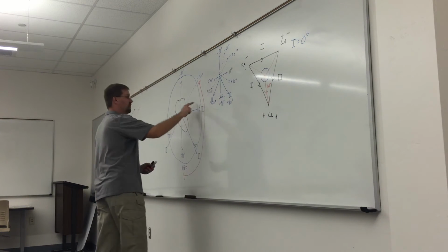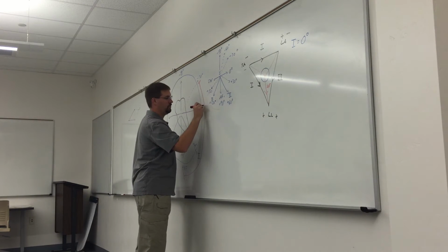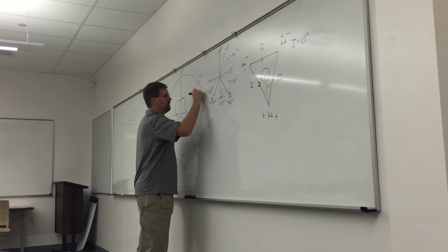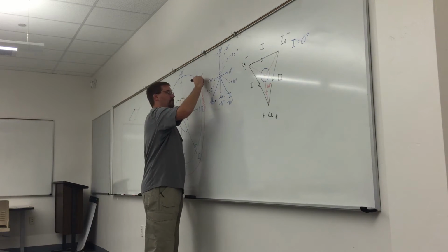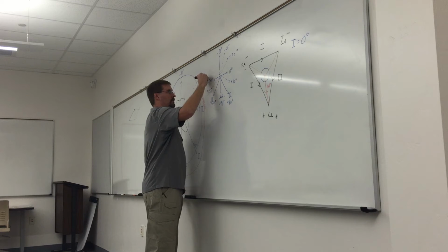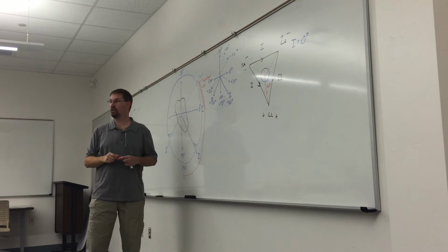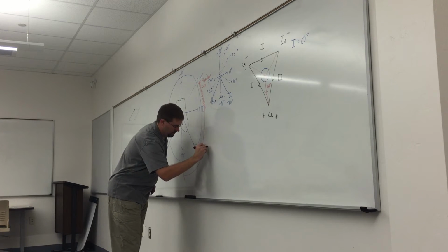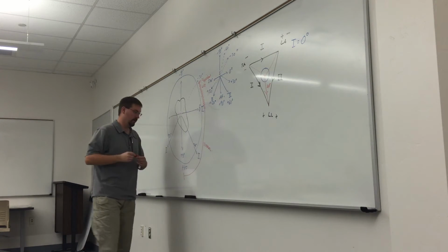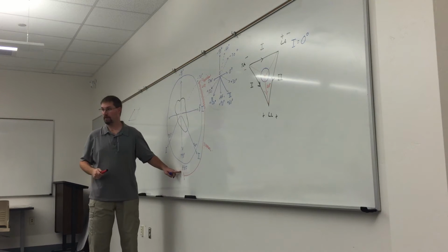So between 0 and -30 is called physiological left axis deviation, because it's still within that general normal range, and perfectly normal is between 0 and +90. You guys okay with that?